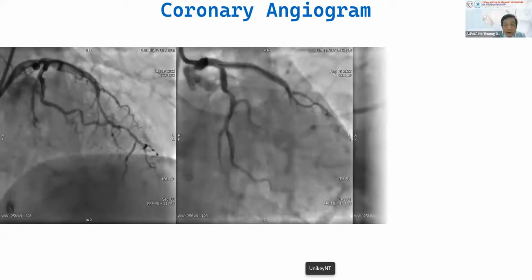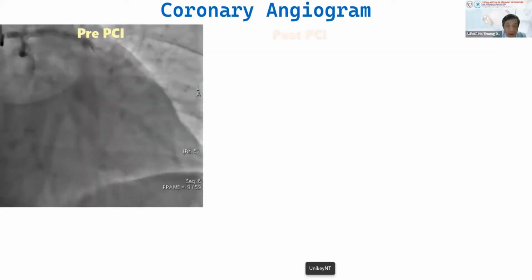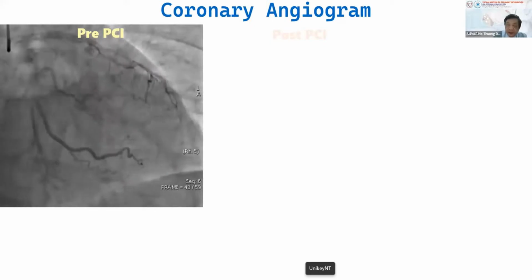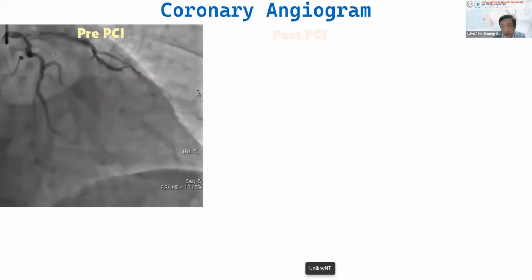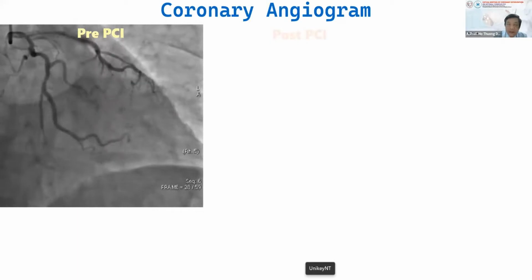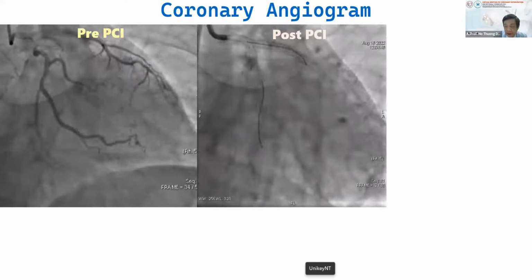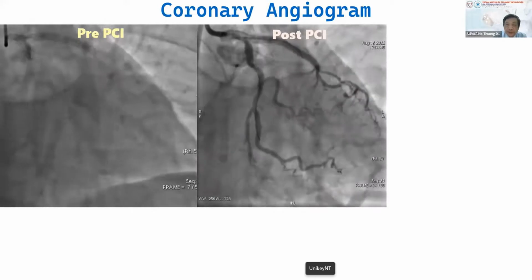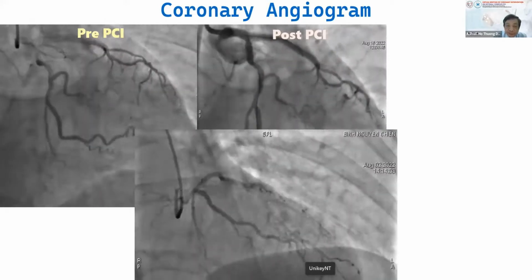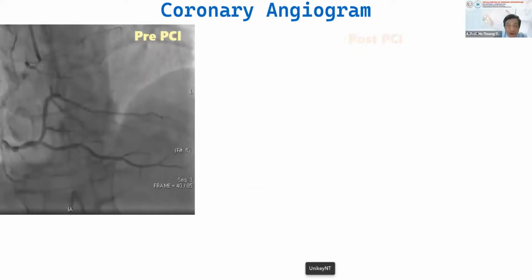And we recall the IVUS catheter did not go distal, but in the mid segment of the stent. But the result is very good, but the file is not good, so I cannot show it here. It is a large result, right, angiography.